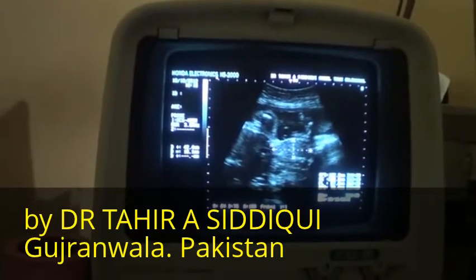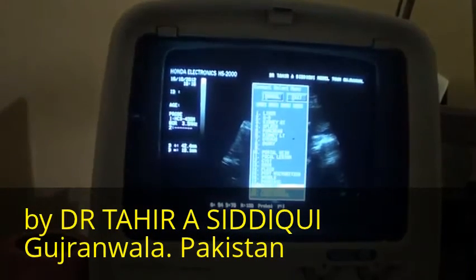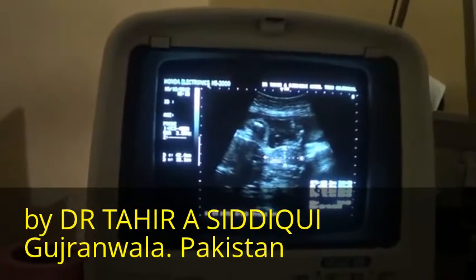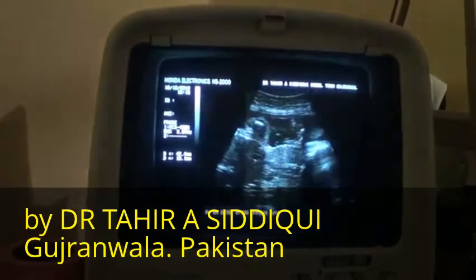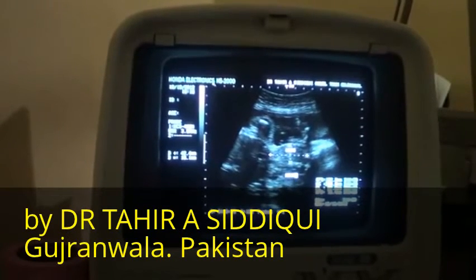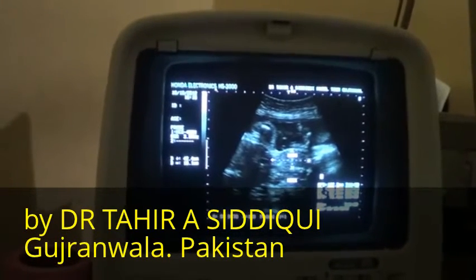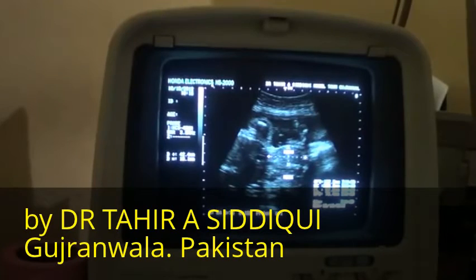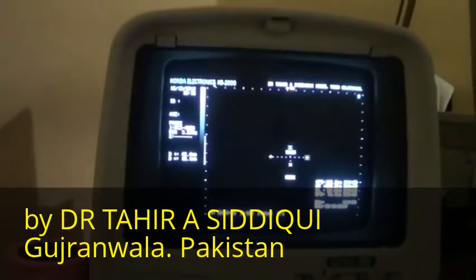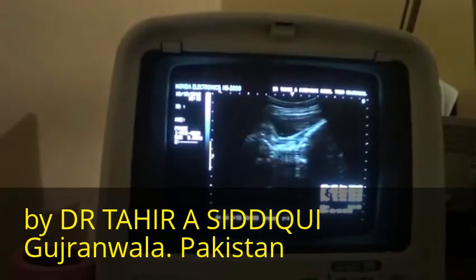And this is where the chest starts. So there is a definite, solid, echogenic, well-demarcated mass at the fetal neck region. Now, it appears to be a thyroid mass. However, the differentials will be significantly much more.